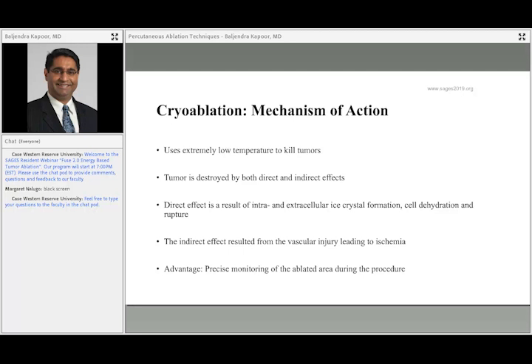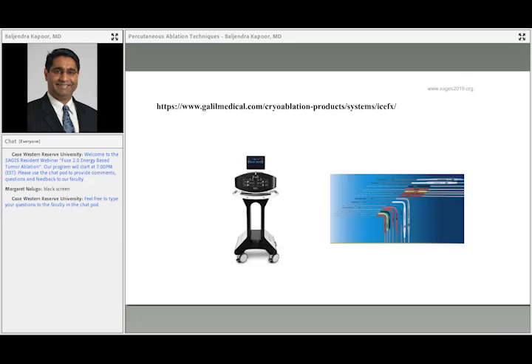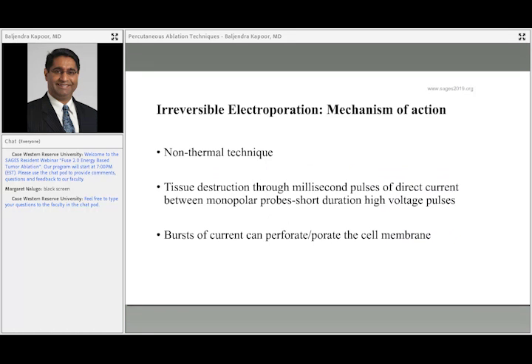The advantage is it provides precise monitoring of the ablated area during the procedure, since you can see the ice ball formation. And this is what it looks like. This is the Endocare system. There are multiple systems for all these that are available. And this is the Galil Medical system with the probes.